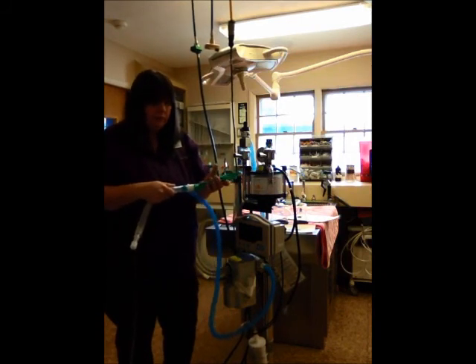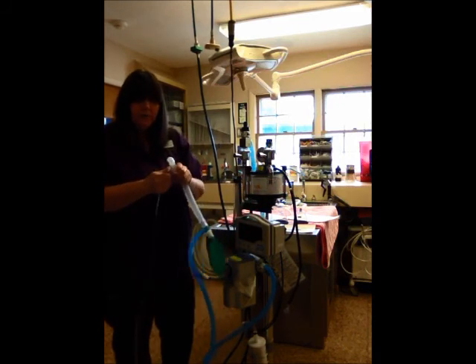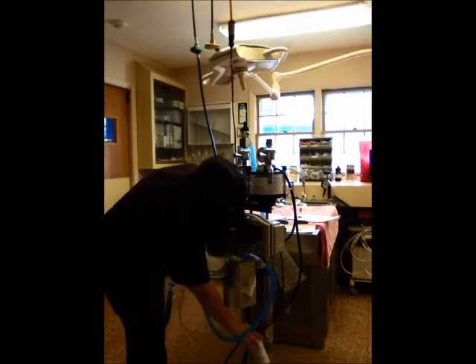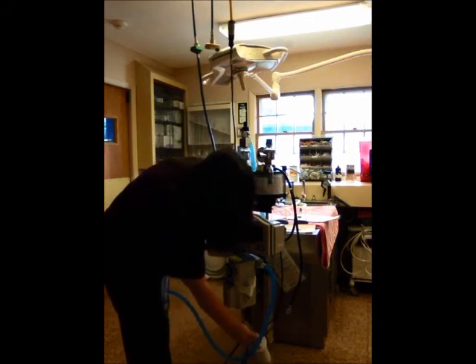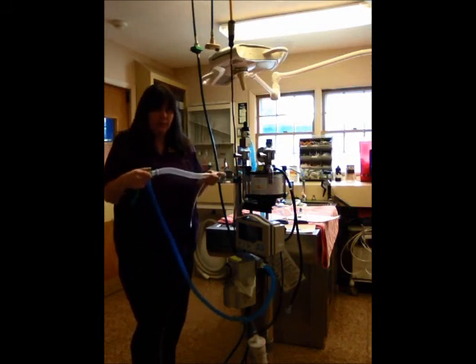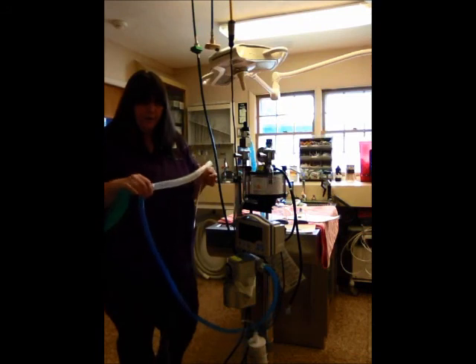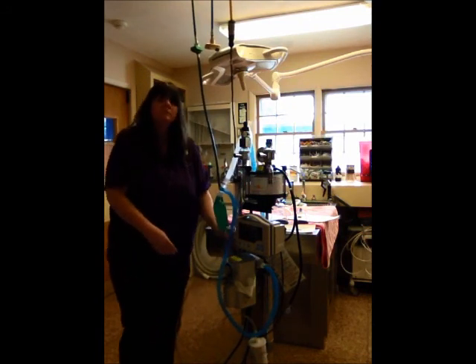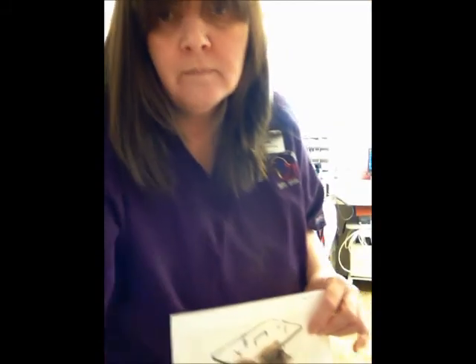Some of it's going to enter the reservoir bag and some of it's going to enter the patient. Whatever the patient exhales is going to leave the exhalation tubing and go directly into the anesthetic absorbing canister. This is to ensure that the patient gets fresh anesthetic gas and fresh oxygen each time he takes a breath. There's no recycling of any of the waste anesthetic gas in a non-rebreathing system. It's usually used for patients under 7 kilograms.